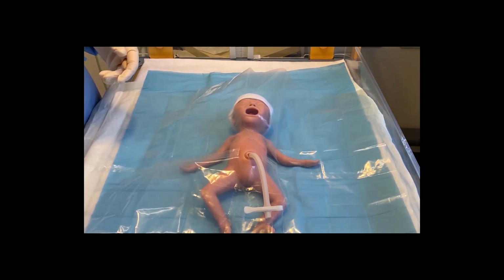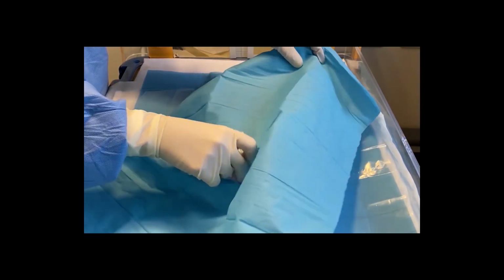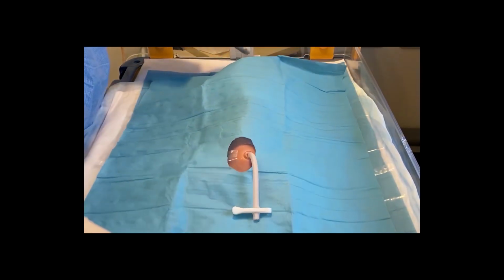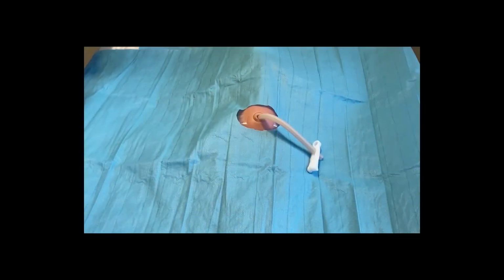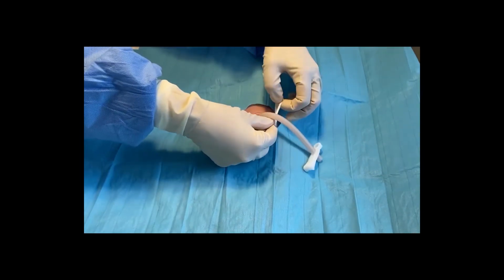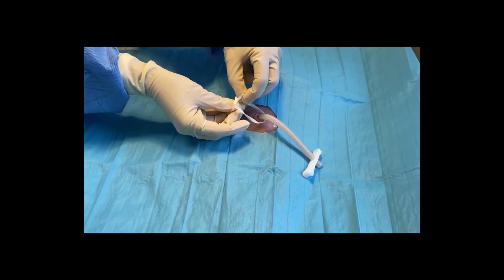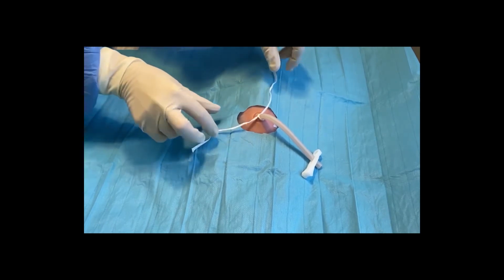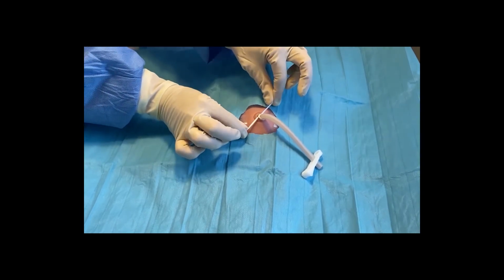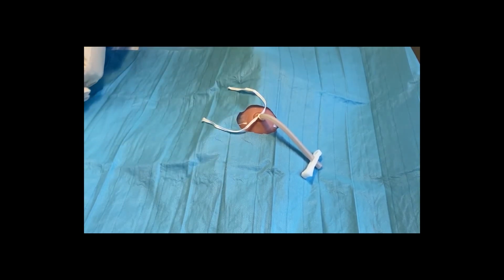For an additional area to have all your equipment, you can always apply a second sterile drape just to give you a slightly bigger sterile field. So now you're going to attach your cord tie at the base of the cord, and it's important to do this because if there's any oozing from the vessels when the lines are inserted, then you can quickly tie this to prevent any excessive blood loss.